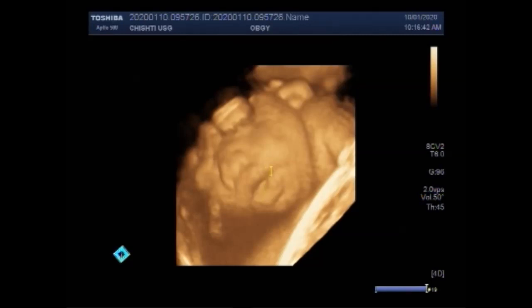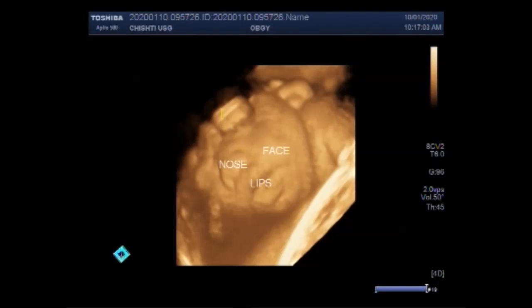This ultrasound video shows anencephaly. You can see the 4D view of the fetus — the fetal face. These are the lips, this is the nose, and these are the eyes.